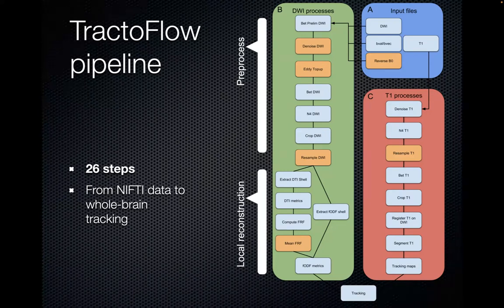So if you throw at Tractoflow an Alzheimer's disease brain or an MS patient with lesions, that's going to talk about later in my research talk, but be careful. Most of our neuroimaging tools out there are developed on healthy, young brains. So challenge the steps, and if you understand what the steps do, you can actually change the parameters yourself.